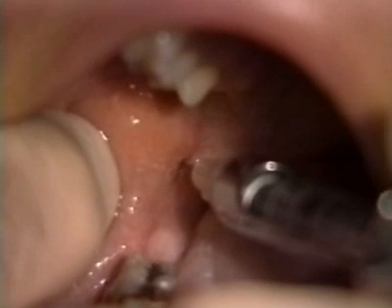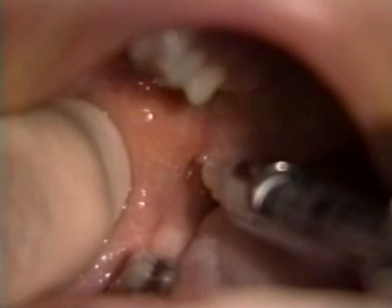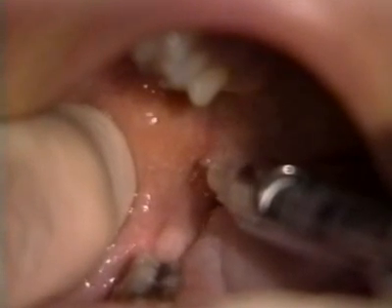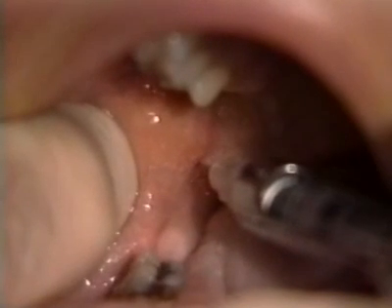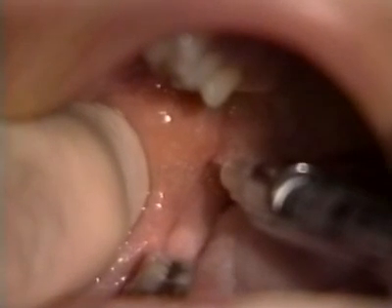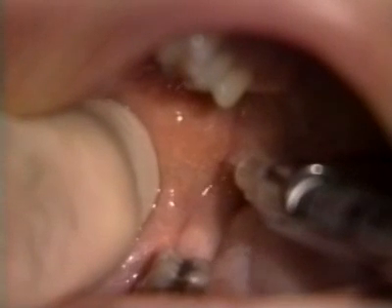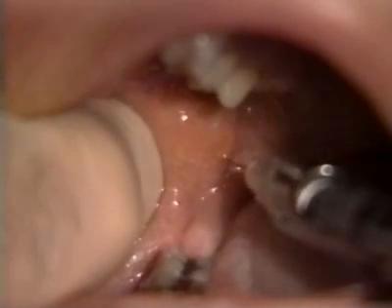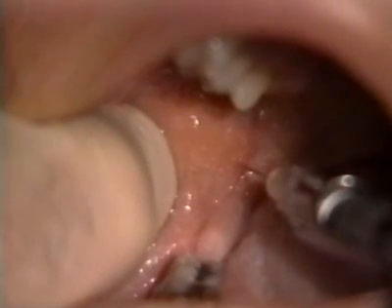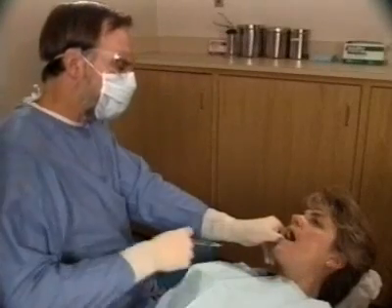Once bone is contacted after an insertion of 2 to 2.5 centimeters, the needle is withdrawn slightly and an aspiration test is performed. After a negative aspiration, approximately 2/3 of the cartridge is injected at a rate not to exceed 1 cartridge per minute. If lingual nerve anesthesia is desired, it can be easily achieved by withdrawing the needle halfway and depositing the remaining third of the cartridge after a second negative aspiration test. The needle is then removed, and the patient is allowed to rest for the 3 to 5 minutes it normally takes for anesthesia to develop.